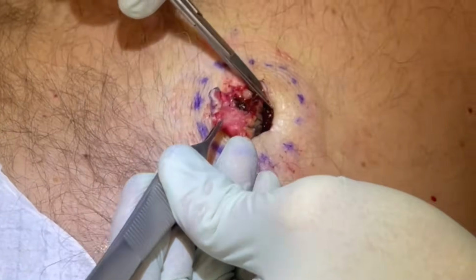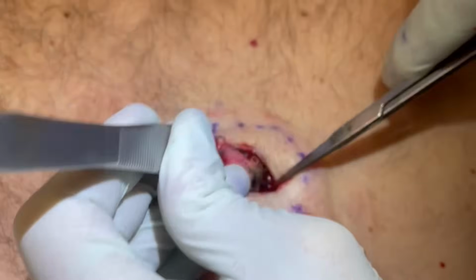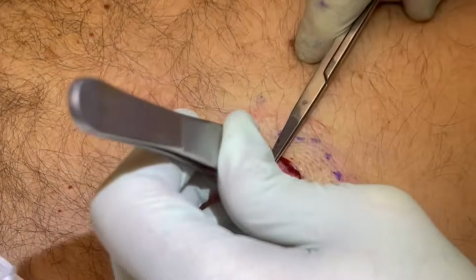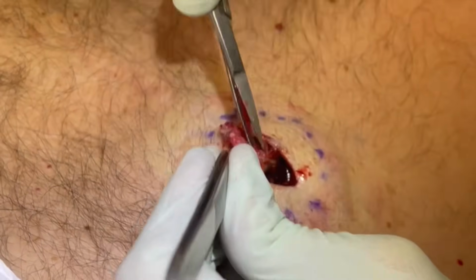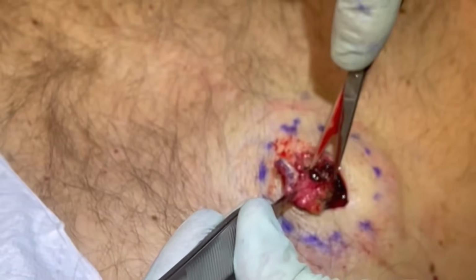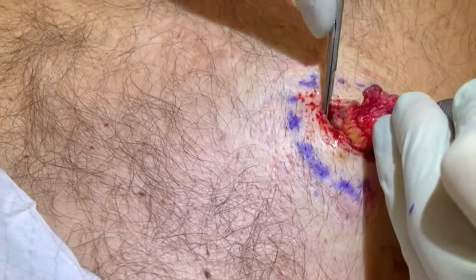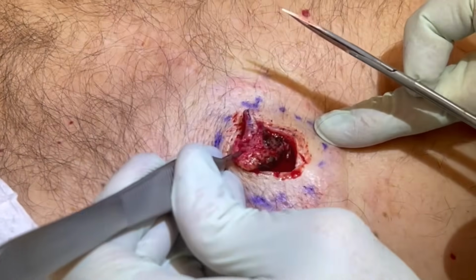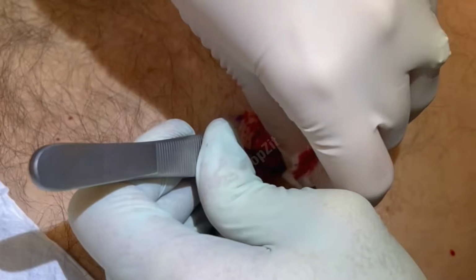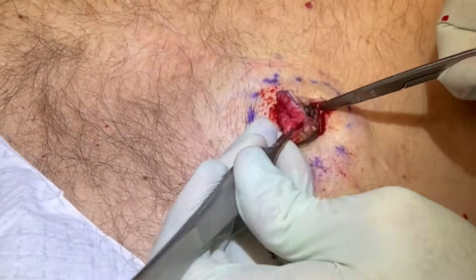A lot of people ask why I do a little skin flap there. You can see on this one especially, that's what I'm holding on to. And then get a vessel at the bottom we'll get in a sec. See the best angle to come at that. On this side here.